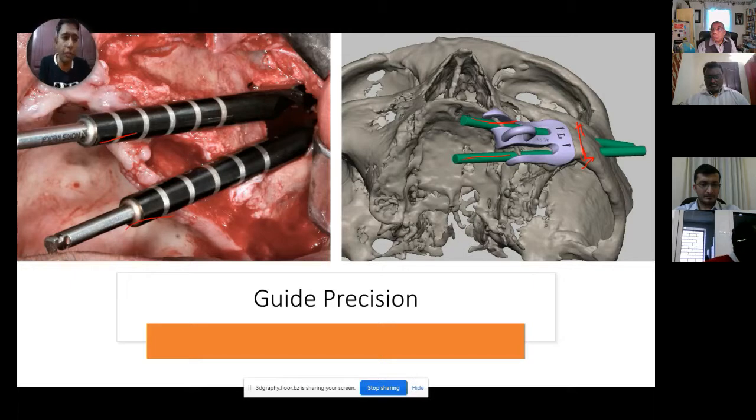Now suppose I make a mistake over here, this area is gone. Then I can place only one implant over there. My entire treatment plan changes. See in this case, with so much atrophic maxilla, I cannot place any implants anteriorly. I have to go for 2 zygomas, and that is why I do not touch cases now without the guides, with a wonderful back-end team I have. I don't have to think otherwise.